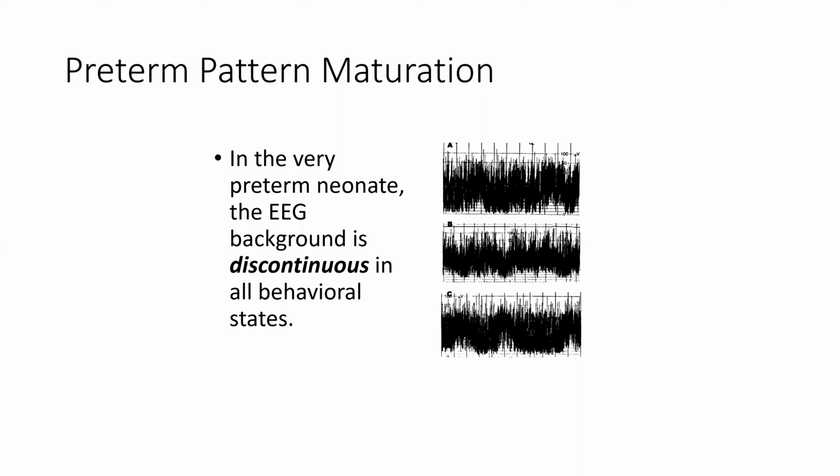So let's talk for a second about how this relates to preterm infant patterns. So we know seizures, whether you're term or preterm, we know those are bad.